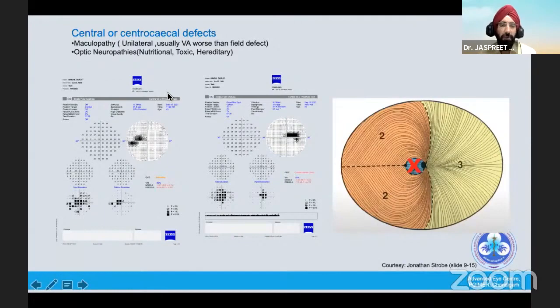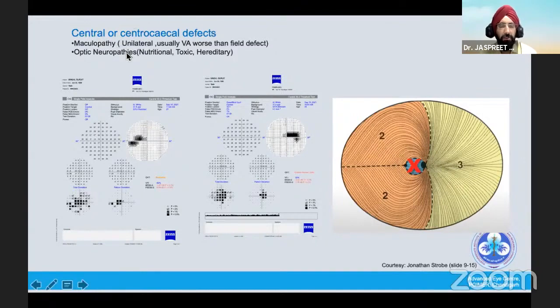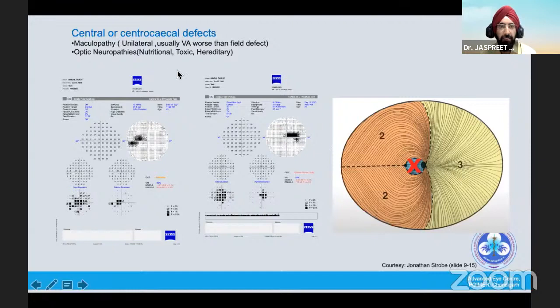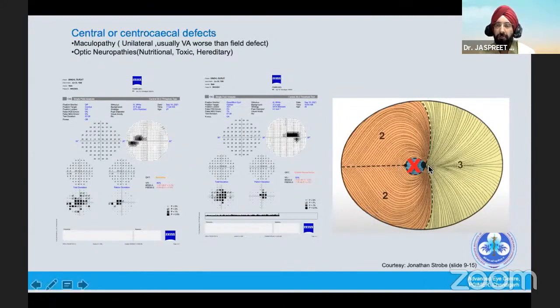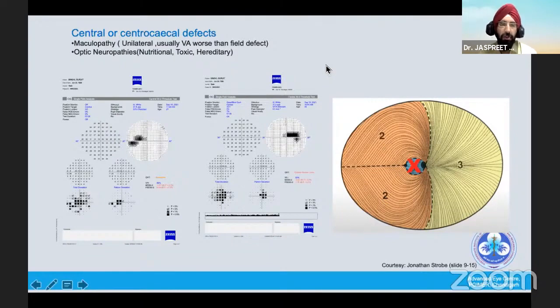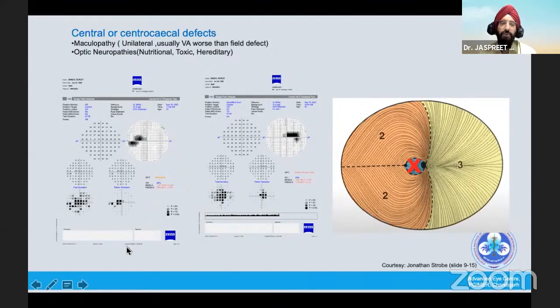Commonly what we see in optic nerve disorders, and sometimes bilateral optic nerve disorder as well, is central or centrocecal scotoma. If you have a unilateral centrocecal scotoma, first check for maculopathy, because the most common cause with low visual acuity would be a maculopathy. In case of bilateral causes, you can see a centrocecal scotoma on the gray scale and on the pattern deviation — this is because of the papillomacular bundle. A centrocecal scotoma results from this small fiber area between the macula and the optic disc. It's bilateral; the causes are nutritional, toxic, or hereditary — for example, Leber's hereditary optic neuropathy. This gives a clue as to what you are dealing with.